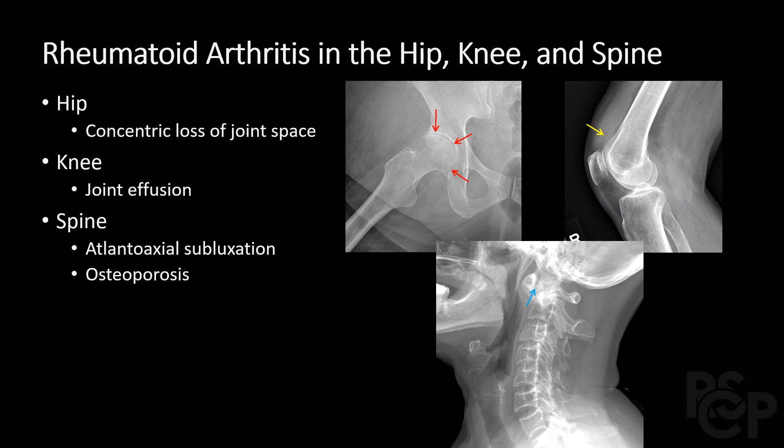Now I'll discuss rheumatoid arthritis in the hip, knee, and spine. The red arrow shows concentric hip joint space narrowing. The yellow arrow shows abnormal soft tissue attenuation anterior to the distal femur, consistent with a joint effusion in the knee. The blue arrow shows subluxation of C1 on C2 with abnormal widening of the atlantodental interval. The bones are diffusely demineralized.